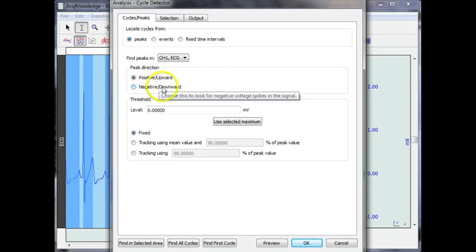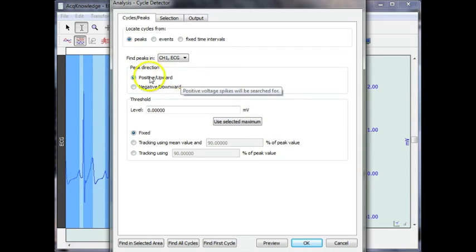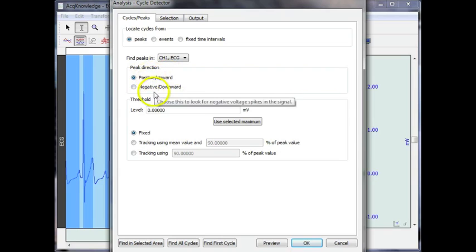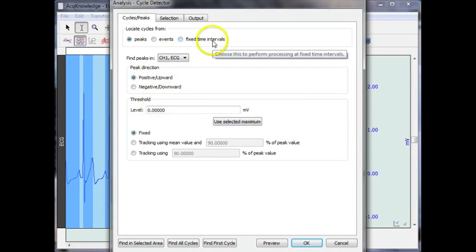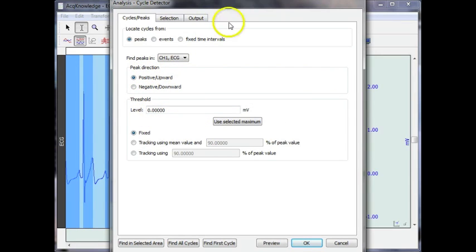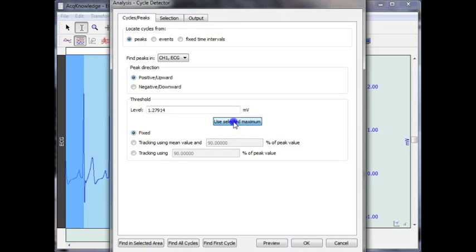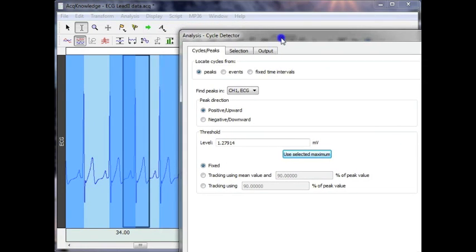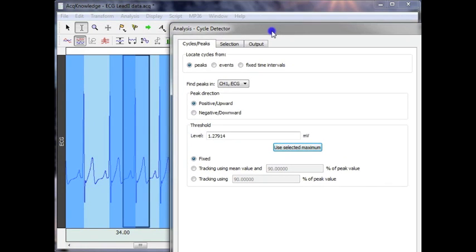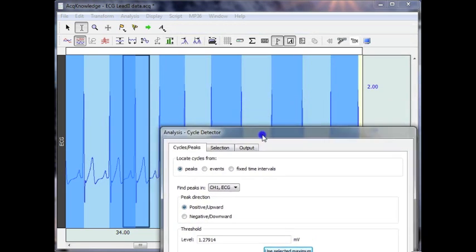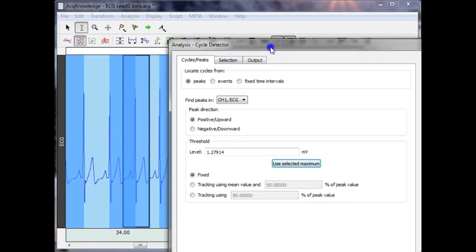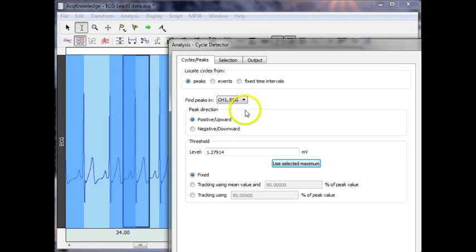And my peak is positive going, it's pointing up. You can also do the opposite, look for negative going events. But in this case, the ECG R wave is positive going. And I'm going to allow the software to take a measurement, set a threshold rather, based on the area that I have selected.